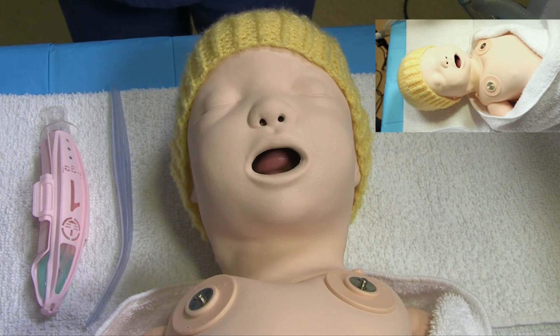Indications for use of a laryngeal mask would be to establish an airway where there has been difficulty with non-invasive support. Also to secure an established airway for continued support.